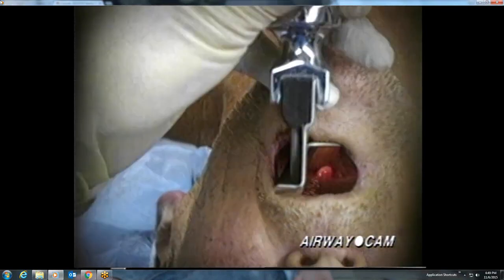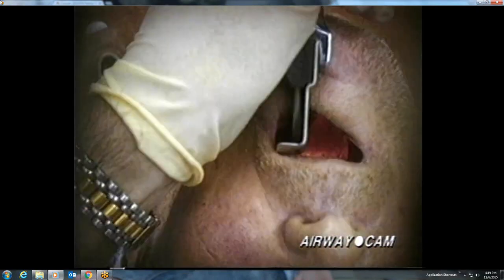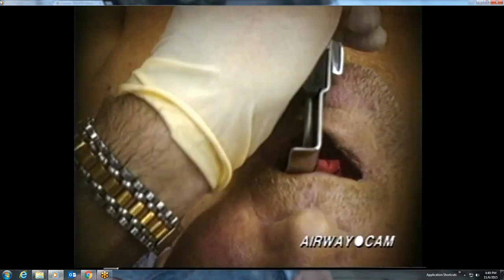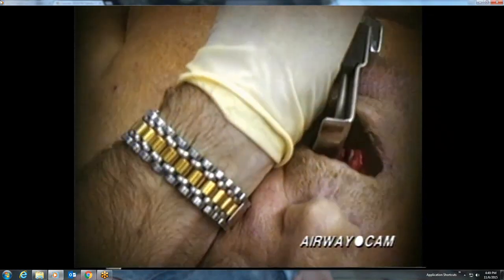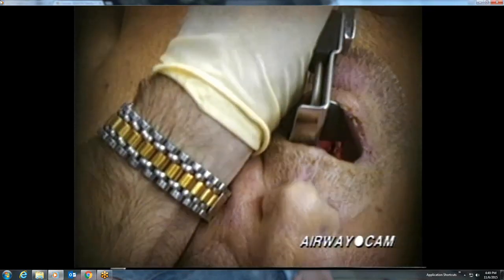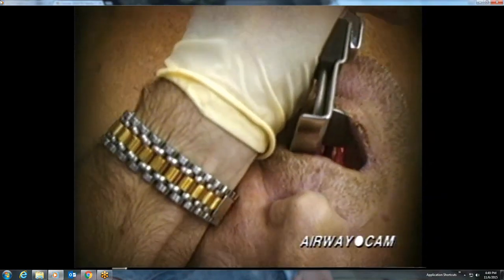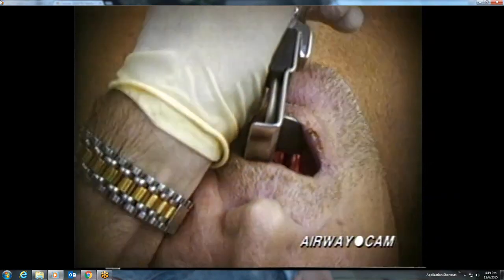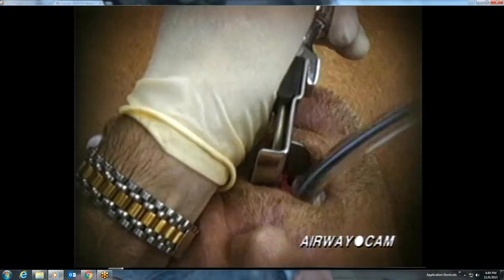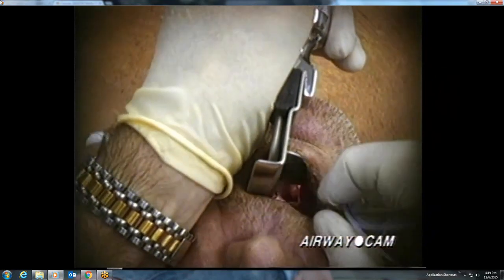Watch as the chin is pushed open with the fourth and fifth digits of the laryngoscopist's left hand. The first landmarks to be recognized are the posterior cartilages and the interarytenoid notch. Unintentionally, the curved blade was inserted slightly deep and picked up the epiglottis directly. The tip of the epiglottis then drops beneath the blade as the blade is adjusted. Using the Mac as a Miller is not a problem, and often deliberately done, particularly with the larger curved blade.